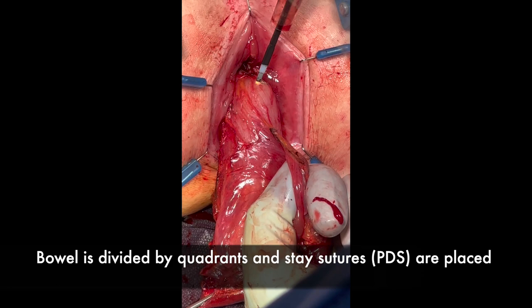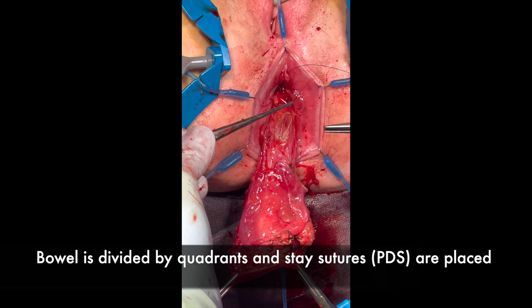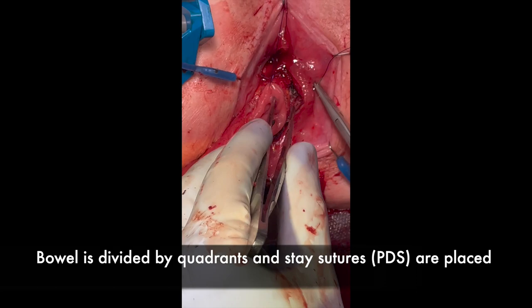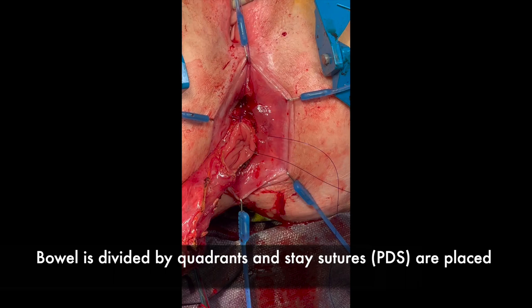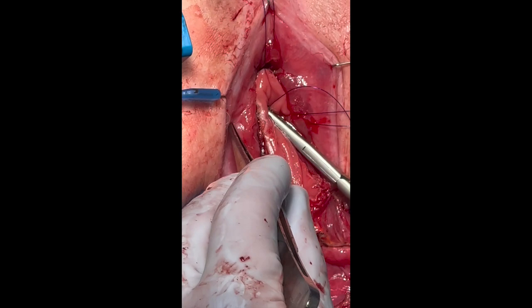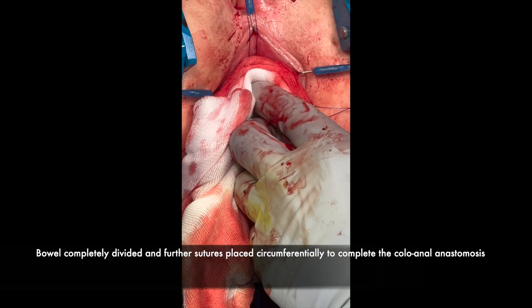The bowel is divided quadrant by quadrant and stay sutures are placed to form the basis of the coloanal anastomosis. Vicryl may also be used for the coloanal anastomosis. Further sutures are placed to complete the circumferential hand-sewn coloanal anastomosis.